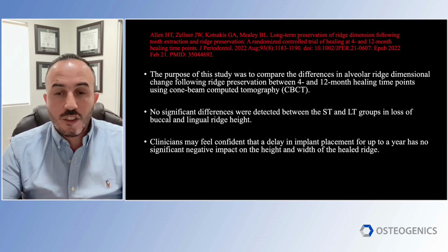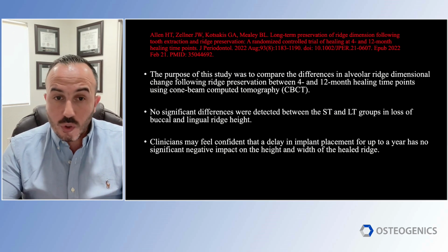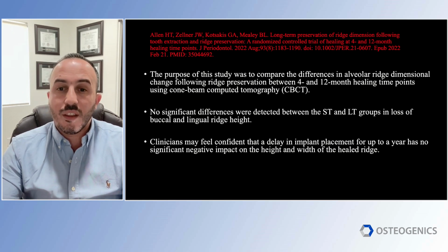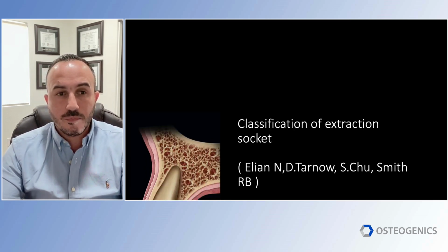Would that change the ridge dimension? Would I lose the bone graft that I did? In this 2022 study by Allen and others, they did a CBCT evaluation. They compared 4 months and 12 months, and we don't see a significant difference between both groups. You can feel comfortable up to 1 year, but to my knowledge, we don't have any study that discusses what happens 2 years or 3 years after if we don't replace with an implant.